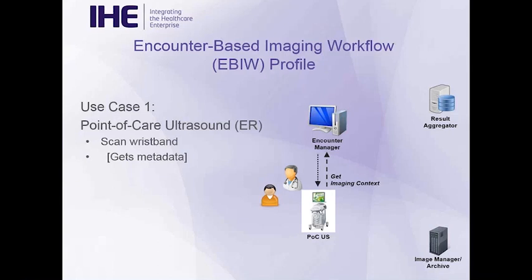So whatever information it can provide back is now available for the ultrasound system. How the encounter manager gets that, we decided not to nail that down in the profile. We could imagine the encounter manager might be a component of the EMR. It might use MPI or IHE patient account management profiles or patient demographics queries. So there are a variety of ways the encounter manager could be integrated into the metadata environment to be able to have that ready to send down to modalities. We decided not to nail that down. We simply gave a list of 4 or 5 reasonable ways. You're required to have done one of them, and we'll see how that works out.